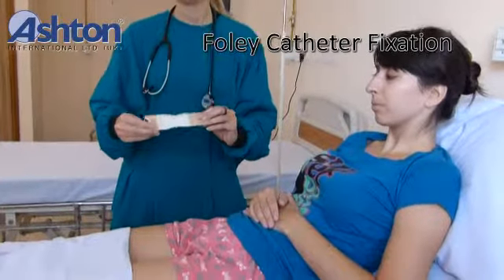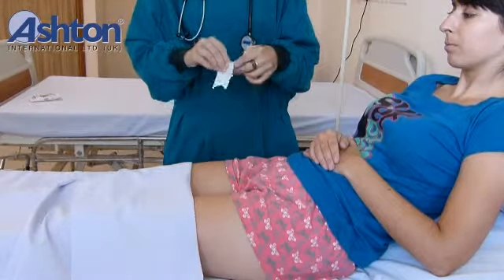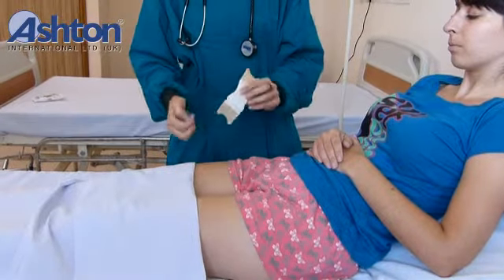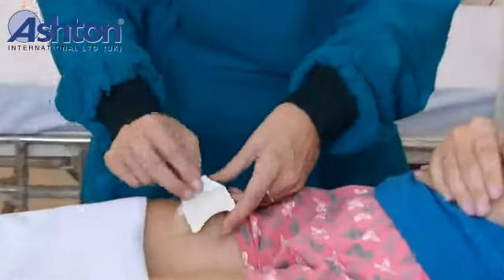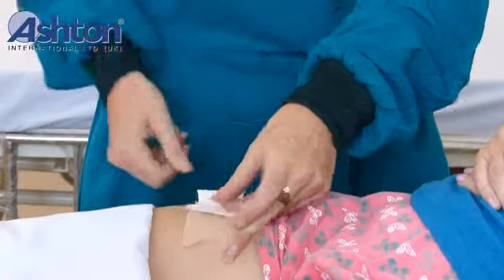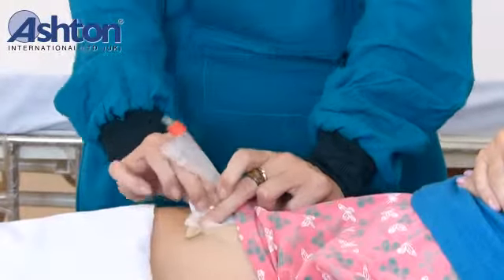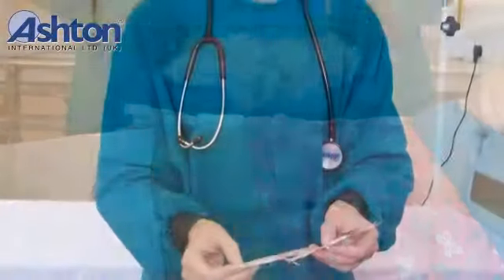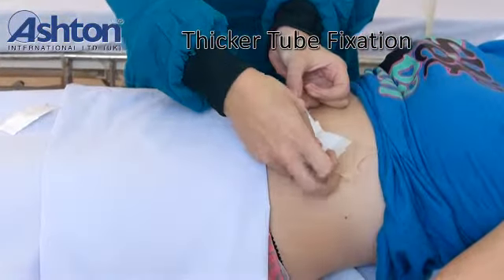Foley's catheter fixation. Peel off the device from the liner. Stick it to the area of application by gentle pressing. Wrap the strip around the tube like this. Foley's catheter support system for other thicker tubes.